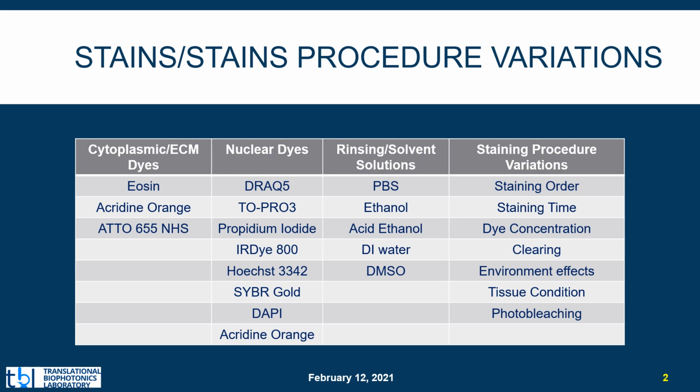While research papers may describe in depth which staining procedure is performed, rarely is there a rationale for why that procedure is used. Our goal in this work was to systematically and quantitatively study the variable parameters used across these different staining protocols, with the hope that we can better understand how to identify and design useful, repeatable staining protocols.